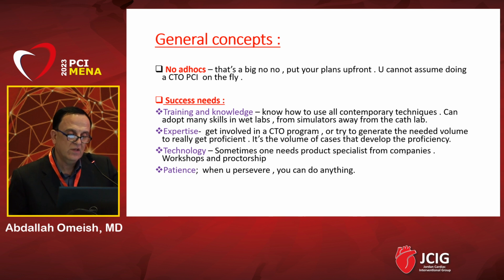General concepts: no ad hocs, that's a big no-no. Put your plans up front, and you cannot assume doing a CTO PCI on the fly. Success needs training, expertise, technology, as well as patience. When you persevere, you can do anything.